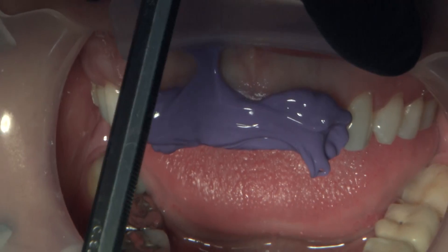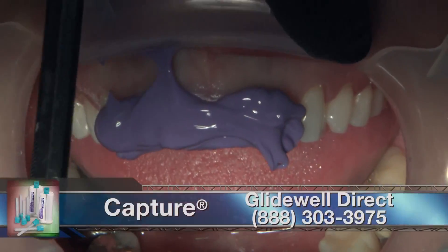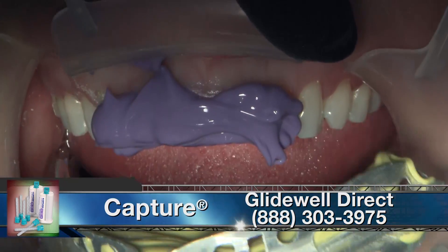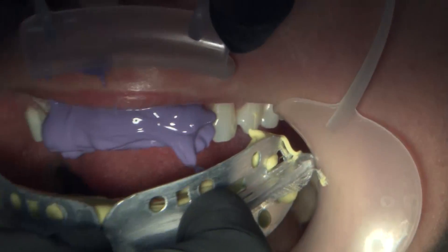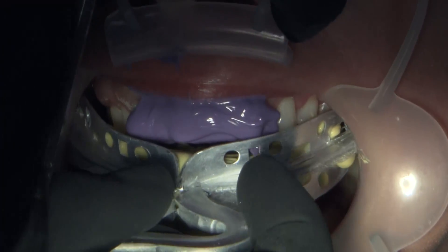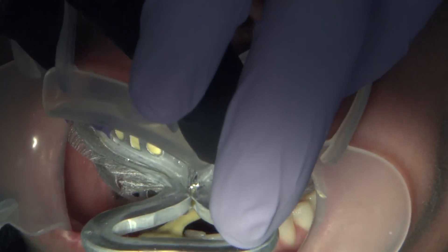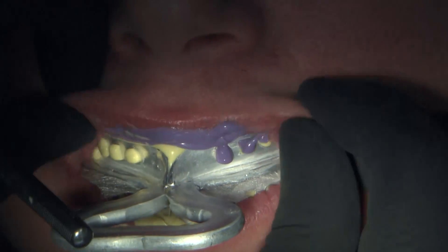For me, the two-cord technique in the anterior is still the gold standard. Is it fun? Not particularly. Is it the easiest way? Certainly not. But it does get the best results. In California, I put the first double zero cord in while prepping. My assistant puts the number two cord in and the copper caps on, and I come back in 8 to 10 minutes to take the impression.